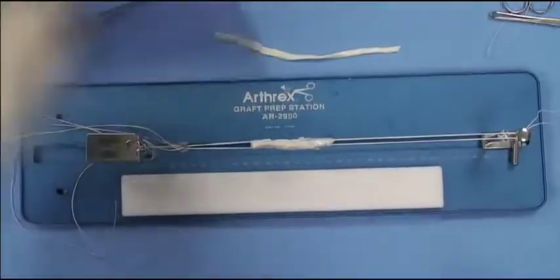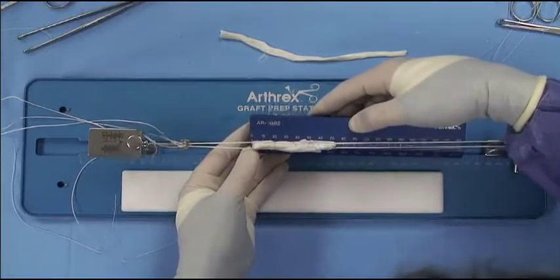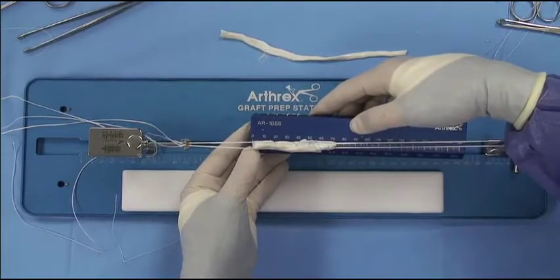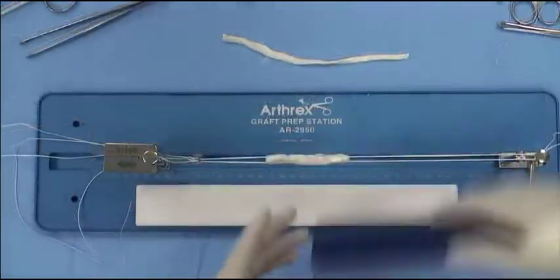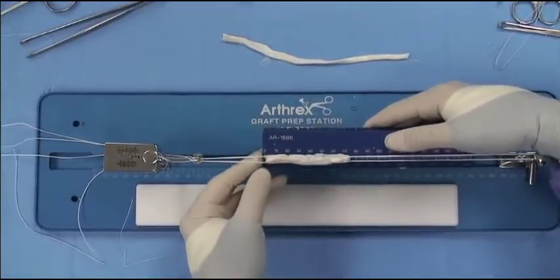You can see that it's under 20 pounds. As you can see here, graft length is 73, meeting our goal of less than 75 millimeters, which is optimal for all-inside technique. So we'll use a 9 by 73.